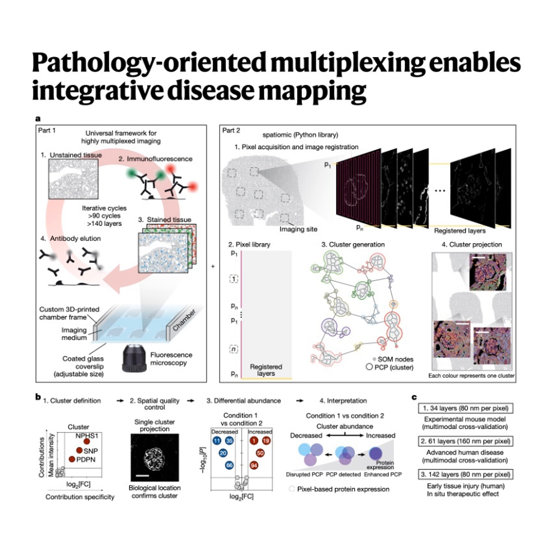80 nanometers. And crucially, they tackled the logistics. They figured out how to process at least 40 archival biopsy samples. We're talking old formalin-fixed, paraffin-embedded tissue, FFPE, the stuff hospitals have stored for years, and process them all in parallel. That's huge for actual clinical research.